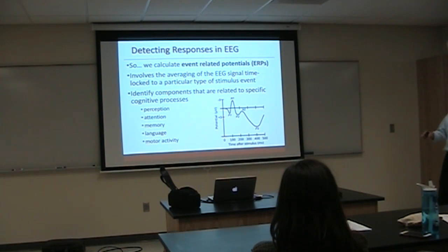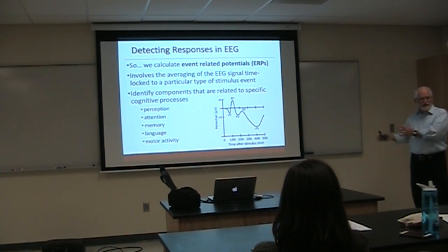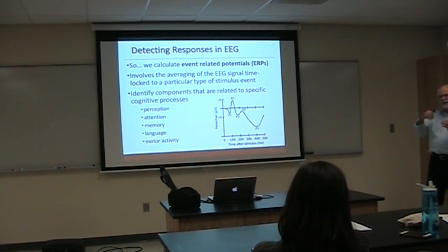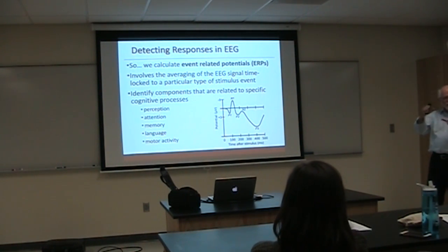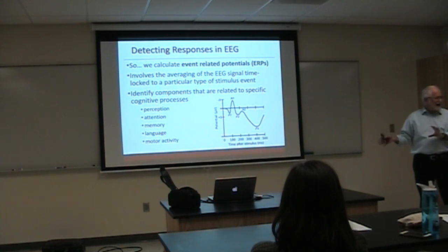And that's why we move to ERP, or event-related potentials. So rather than just looking at raw EEG, what we're going to do is take slices of that raw EEG where we, the experimenters, have somehow controlled the situation, calling your attention to a specific thing that happens again and again and again. Like we can play a tone of a certain frequency again and again, and watch what your brain does in response to that specific tone, and filter out all the other things that you were thinking about before and after that tone occurred. Does that make sense?